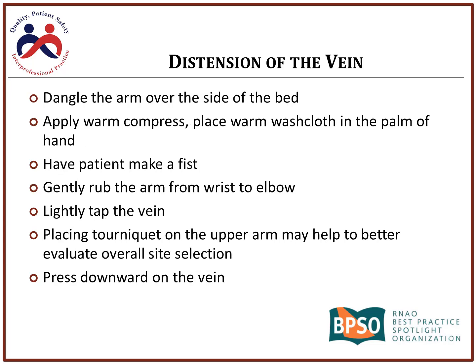Now, distension of the vein. This can be tricky. Sometimes our patients come in, they're dehydrated. What you might want to do is just, I found probably the best way is just have the arm dangle over the side of the bed or the side of the stretcher.